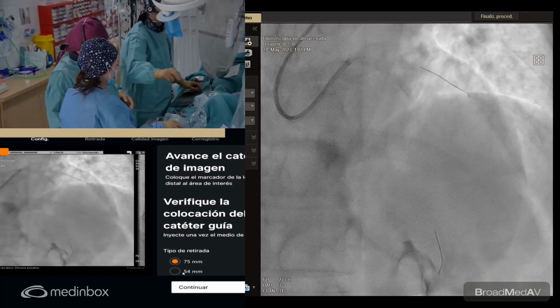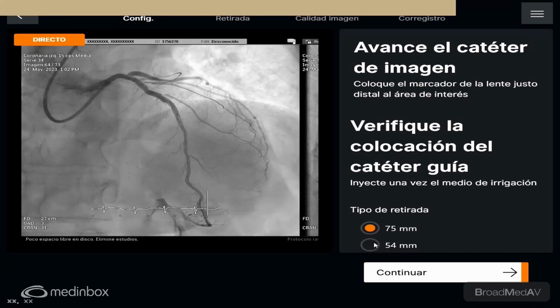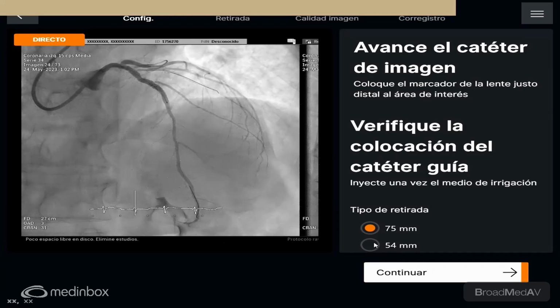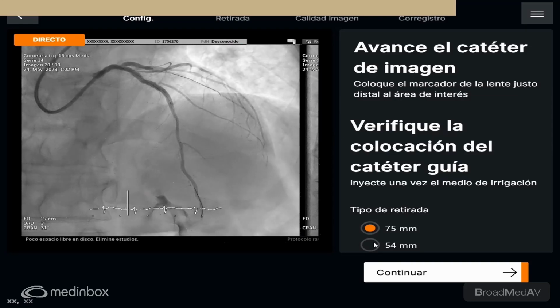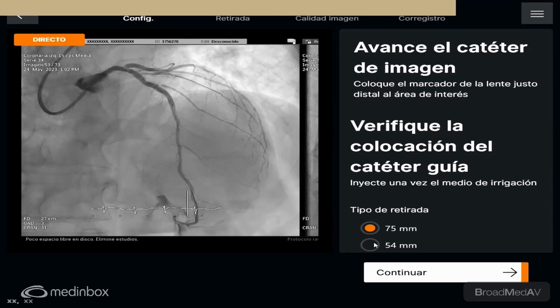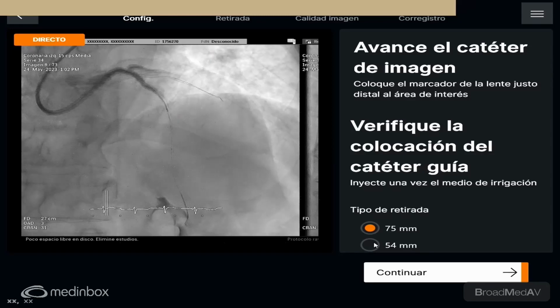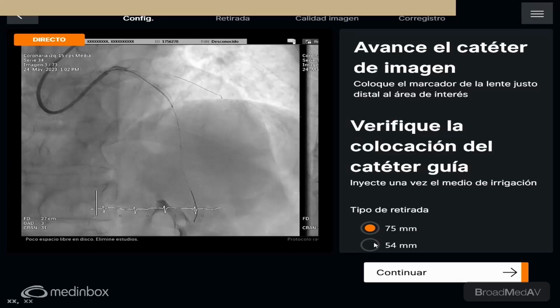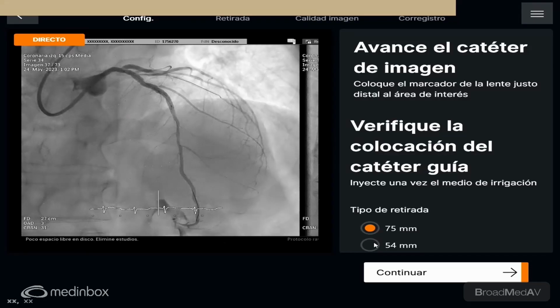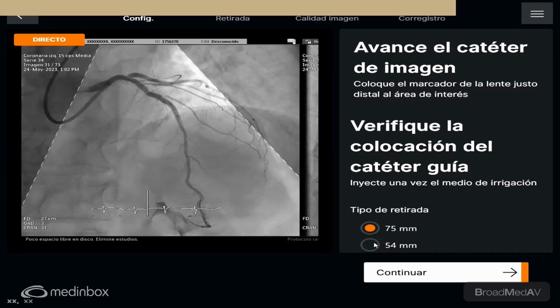Let's check with the last cine we did. We believe the angio. I think the result is quite good. Obviously, the more proximal, the mid part of the stent is the worst part, but the area is quite good. The three side branches are patent, and I think it's a nice result. What do you think? We can do another orthogonal projection. It's a very good result, no?